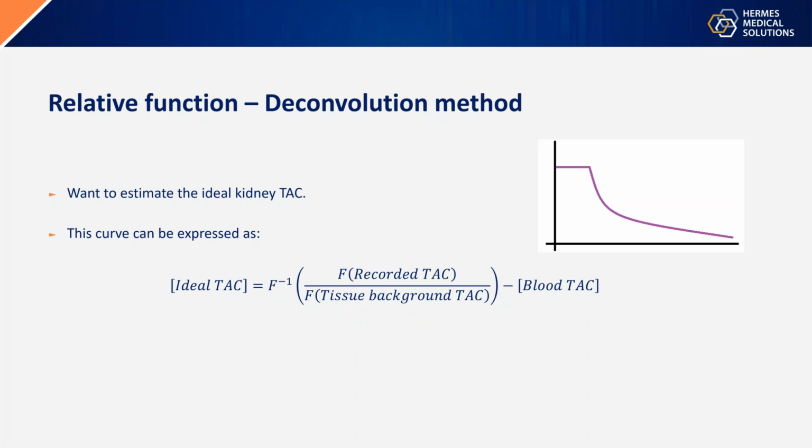It is certainly solvable, but when we compare the methods, I'm going to discuss a little bit why it isn't used as often as the others. Even just the subtraction of the blood activity curve is a non-trivial problem, since the nature of these Fourier transforms forces us to assume that the blood activity curve comes in the shape of one or more boluses, which it isn't, as we saw previously.